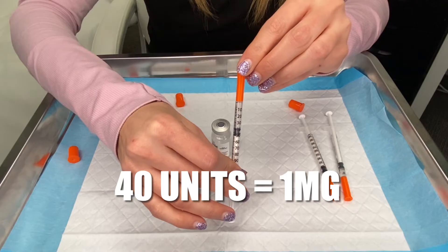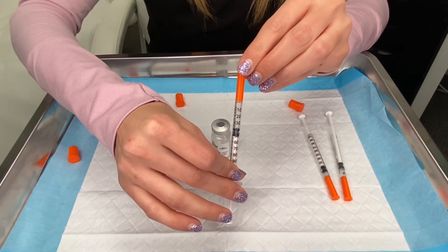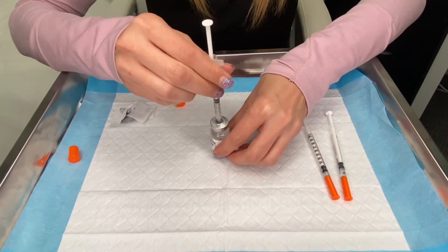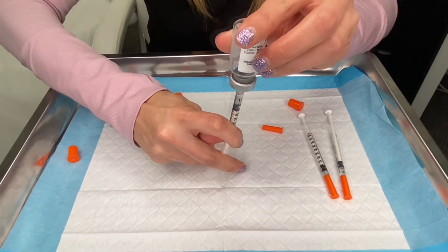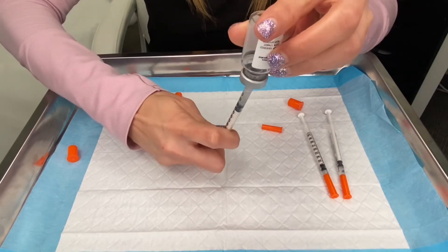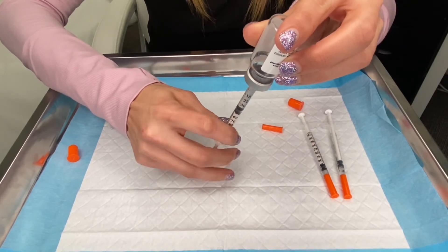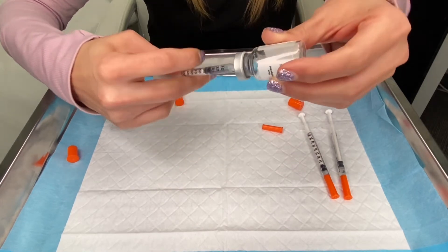The dose for month three is at the 40 unit line, and this is the one milligram dose. So the doses for the first three months are doubling: month one was 10 units, month two is at the 20 line, and month three is at the 40 line. In milligrams it's also doubling — month one is 0.25, month two is 0.5, and month three is one milligram.